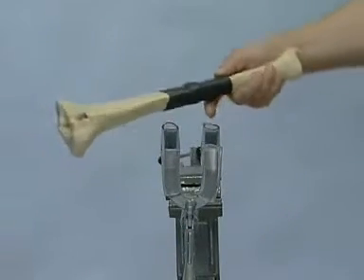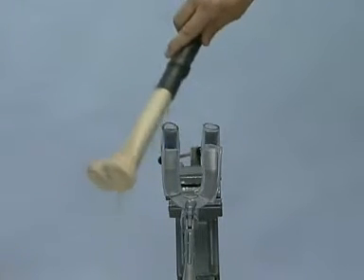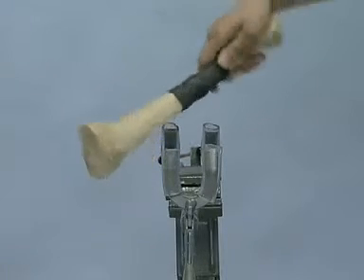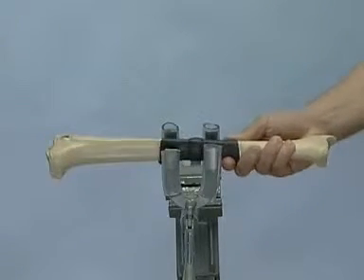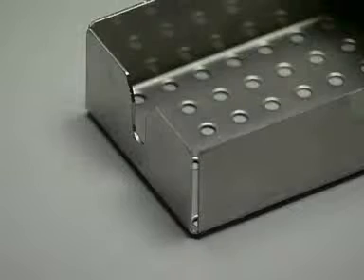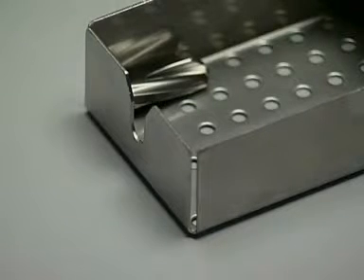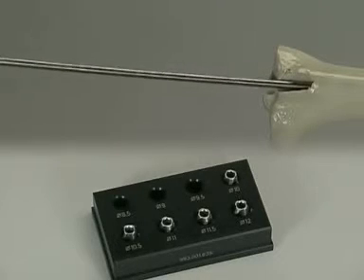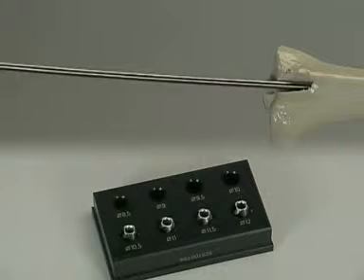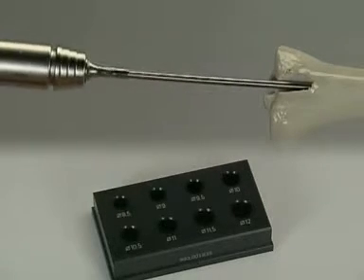A lot of debris is produced with the pseudarthrosis in artificial bone and can be knocked out. In the clinic, the reamer head is removed by placing it in the slot of the removing tool for reamers and pulling back the flexible shaft. The reamer and shaft are guided into the medullary canal over the reaming rod. Reaming is continued in 0.5mm steps until a diameter of 12mm is reached — that is, 1mm larger than the diameter of the nail to be used.